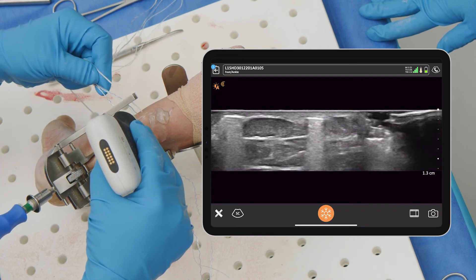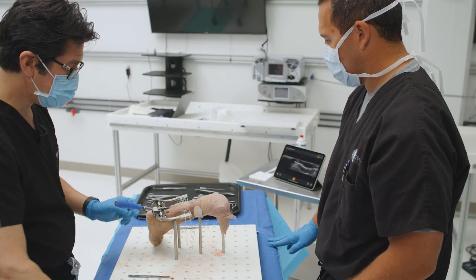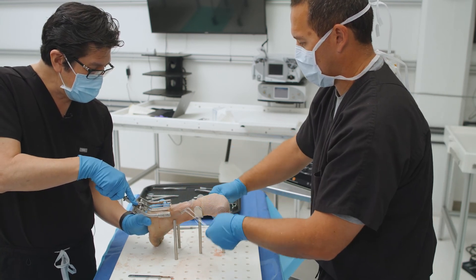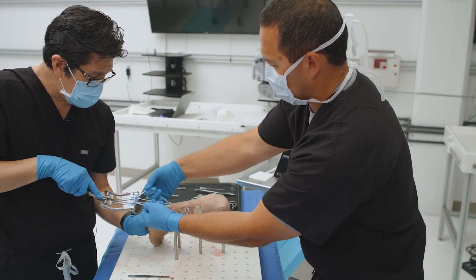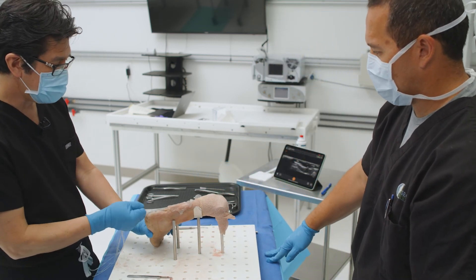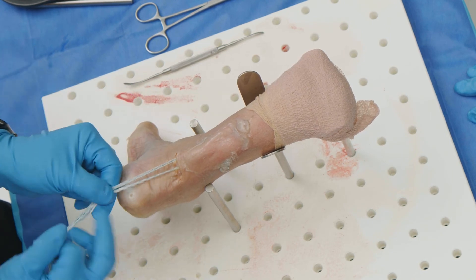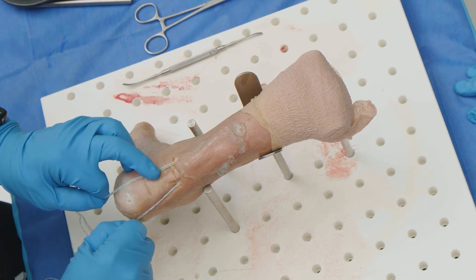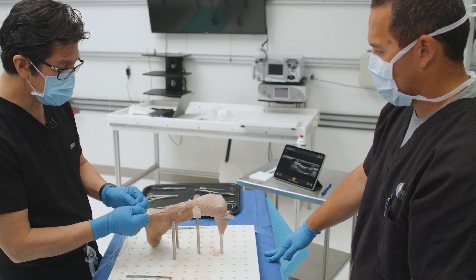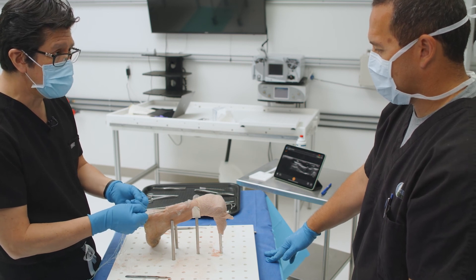You can easily redo any of these to make sure you're in the tendon appropriately. At this point the ultrasound portion is finished and all we have to do is pull all these sutures through our distal incision. You now have full control of your Achilles proximally. We just need to pass them under the skin to the calcaneus and fix them — one on each side — and that will hold it in place to complete your PARS Achilles repair. Using ultrasound is absolutely necessary; without it this is a very tenuous procedure with a high chance of failure because you might easily miss.